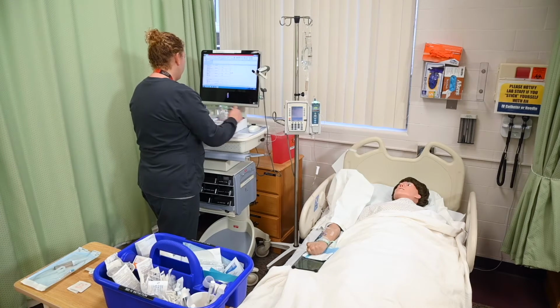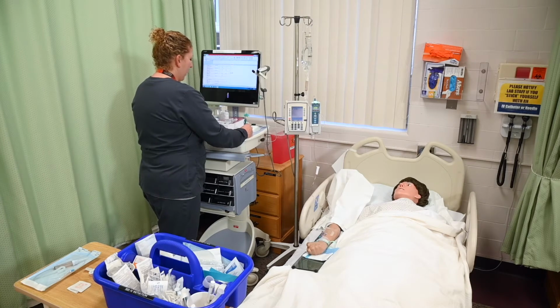I have ceftriaxone 1 gram and 50 mLs of sodium chloride. I need to give 50 mLs over 30 minutes. There's 60 minutes in 1 hour. I'll be administering this IV Piggyback medication at 100 mLs per hour.